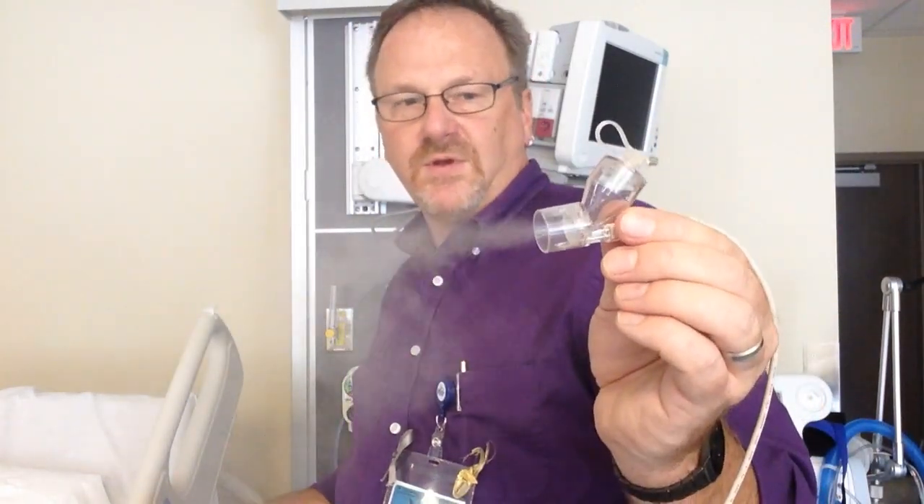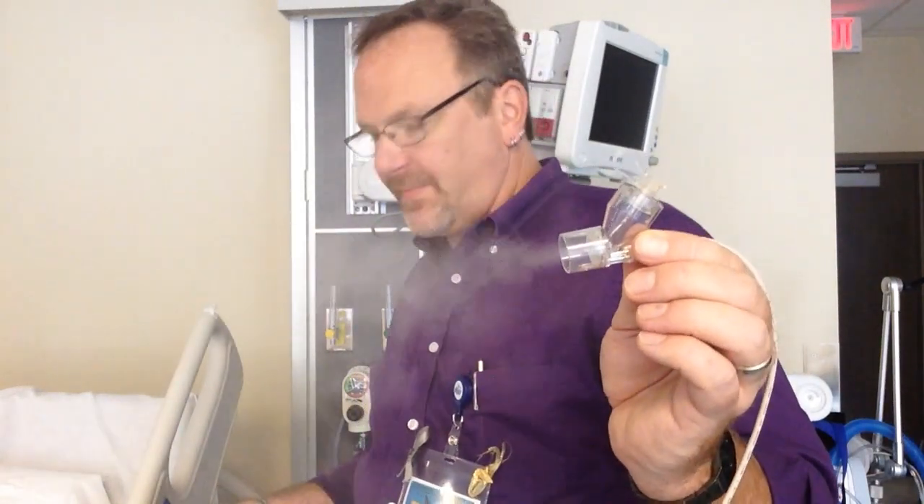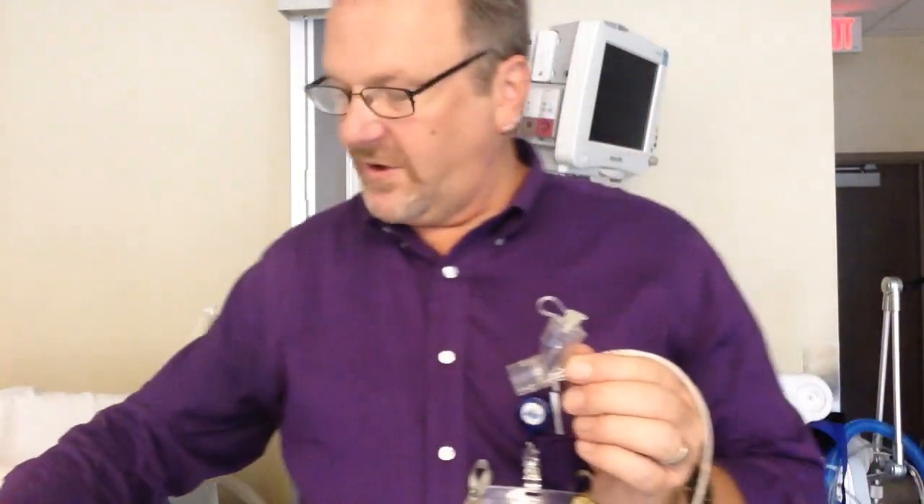This can go on a BiPAP, it can go on a ventilator, it can go on pretty much anything — mouthpiece or mask. What we have here is a mouthpiece.